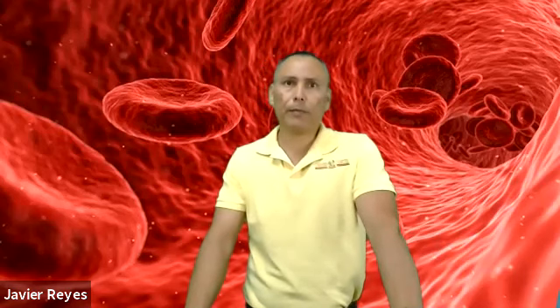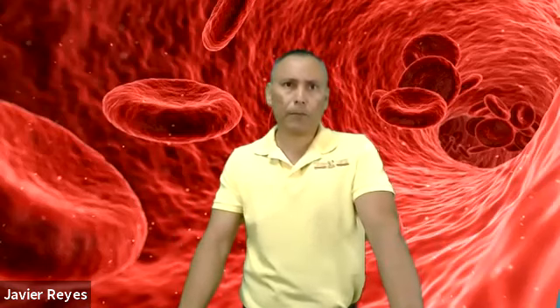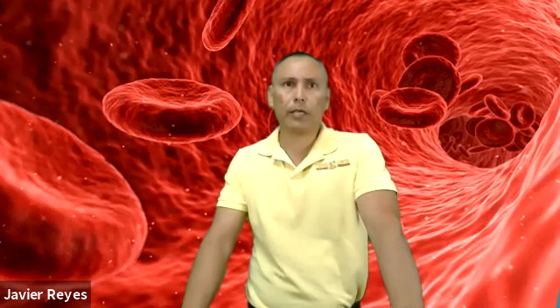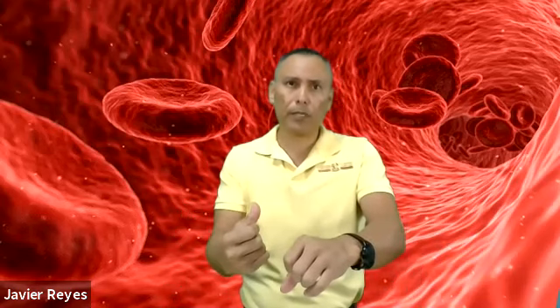Tube vacuum. When you have a tube that you suspect maybe doesn't have enough vacuum, or it started but then it stopped, go ahead and try another tube. Just have extra tubes handy in case one of them does not have enough. Another problem is loss of vacuum due to the bevel being partially out of the skin, when you insert the tube or when you're handling the tubes.